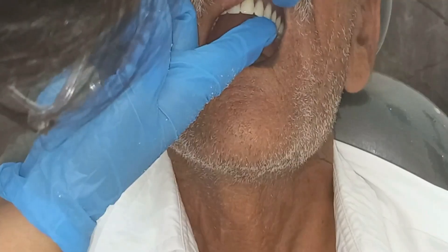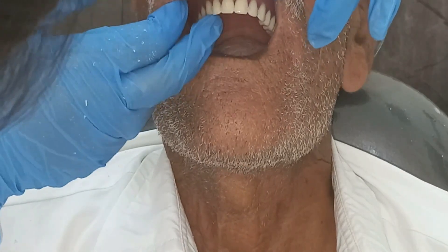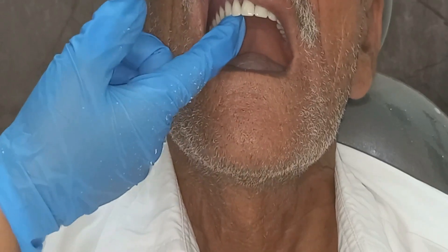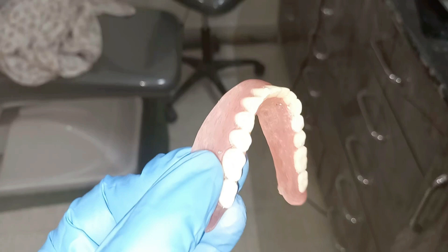Look at the figure — we are applying pressure on the premolar and molar region on one side of the arch, and there is no rise on the other side, meaning the denture is completely stable. You can also see how to apply pressure on one side to evaluate stability in both maxillary and mandibular dentures.